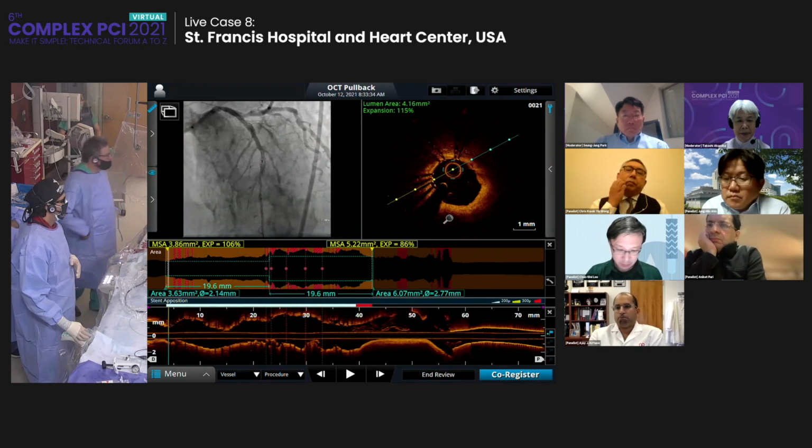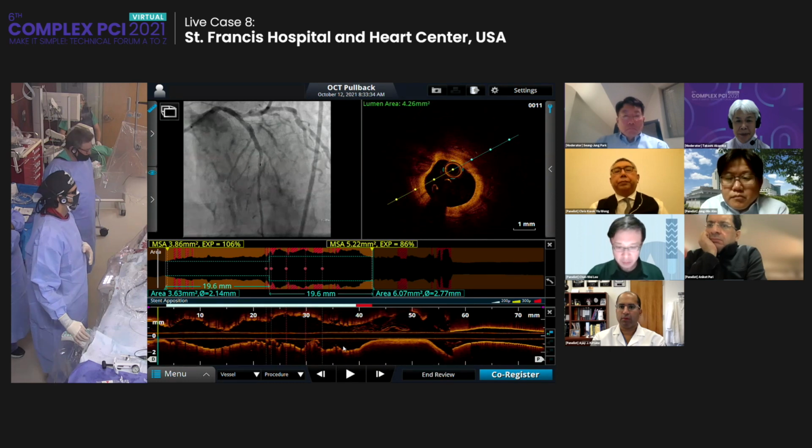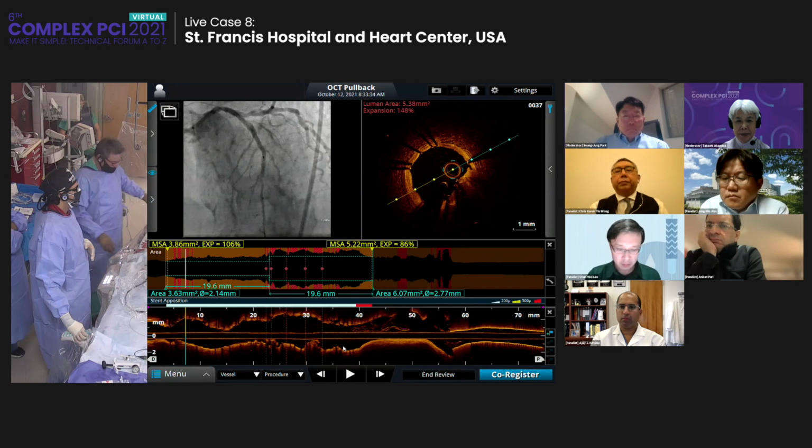So what we're going to do is just play through this and show you what happens to the fractures. I'll go slowly. Where the blood vessel is going to yield is at these sites of fractures.